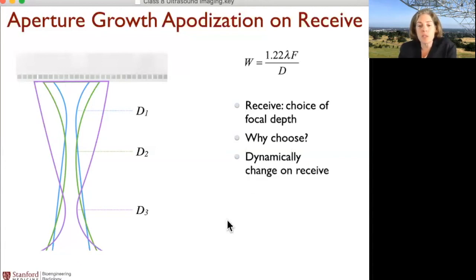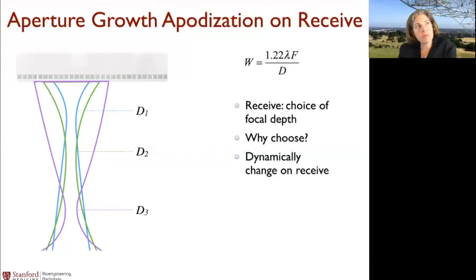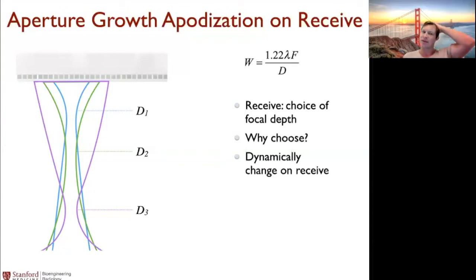It improves your images. Is it electronically inexpensive to listen, if we're trying to make a low power device? It's really the transmit that burns a lot of the power, right? Yeah, right. You're going to put power in on the transmit, and then on the receive side, the echoes are going to power up the piezoelectric crystal, because it's the echoes that power it. You have to individually amplify every signal, so maybe that's expensive. I'm wondering why we wouldn't always be receiving on all channels, or at least using this technique, and maybe we are.